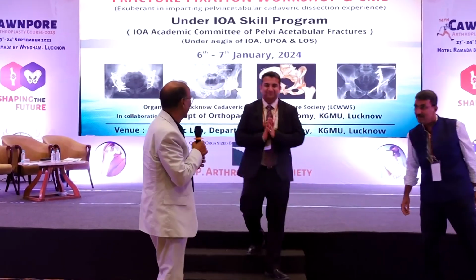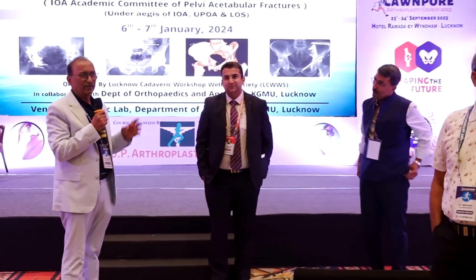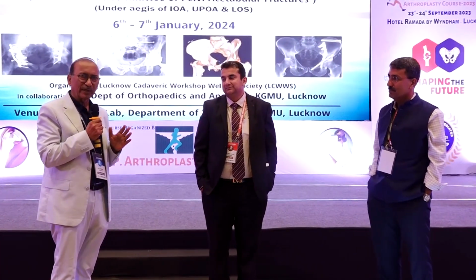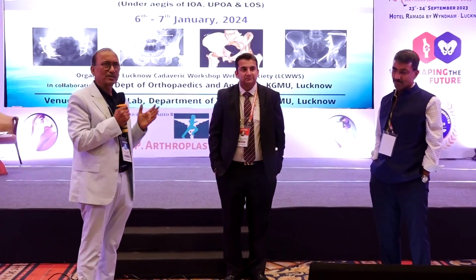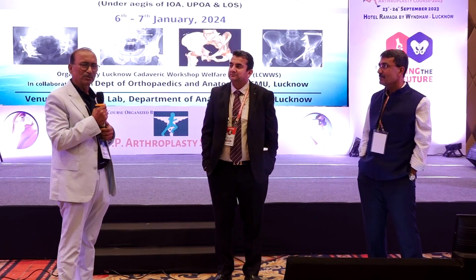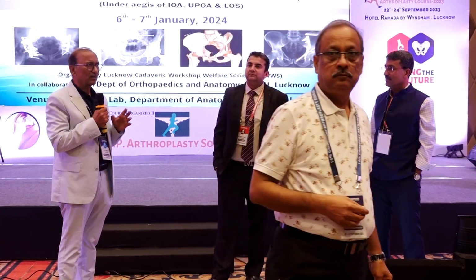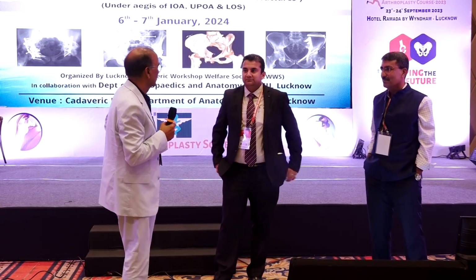Thank you, Dr. Anil. Thank you, Mrinal. The history was significant. I think Dr. Anil was also nodding when he said that after the bipolar surgery, the lady was always in pain while walking, which was progressing. So probably there was a minor crack while the first surgery was done, and a trivial fall, a trivial injury, led to a bigger fracture. So it's always prudent to check when you are doing a hip, as minor cracks can extend and become a bigger one. They can be checked at that time. We have all seen it happening. And it is a cemented use and an uncemented use.